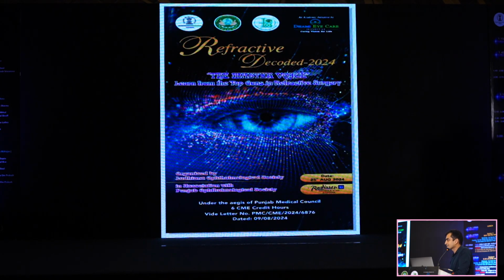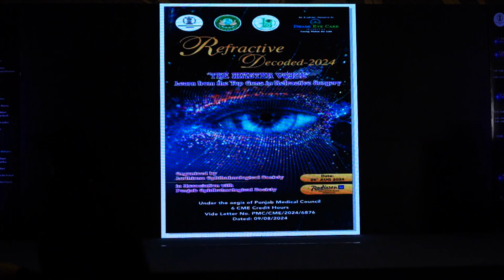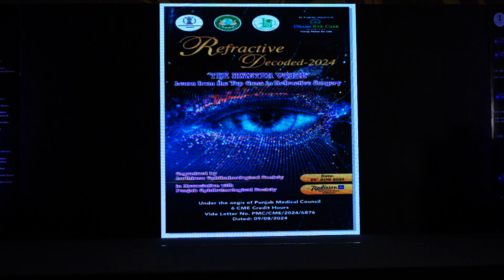Thank you, Sahil. That was a very good presentation, and you stuck to some very important points. And one message that you gave was very important, that just one reading on the Pentacam map doesn't help, because BAD may show, even overall D can be a little suspicious in the yellow zone or so, but then you have to see other things, like what is the pachymetric progression index, and that also is an important thing.